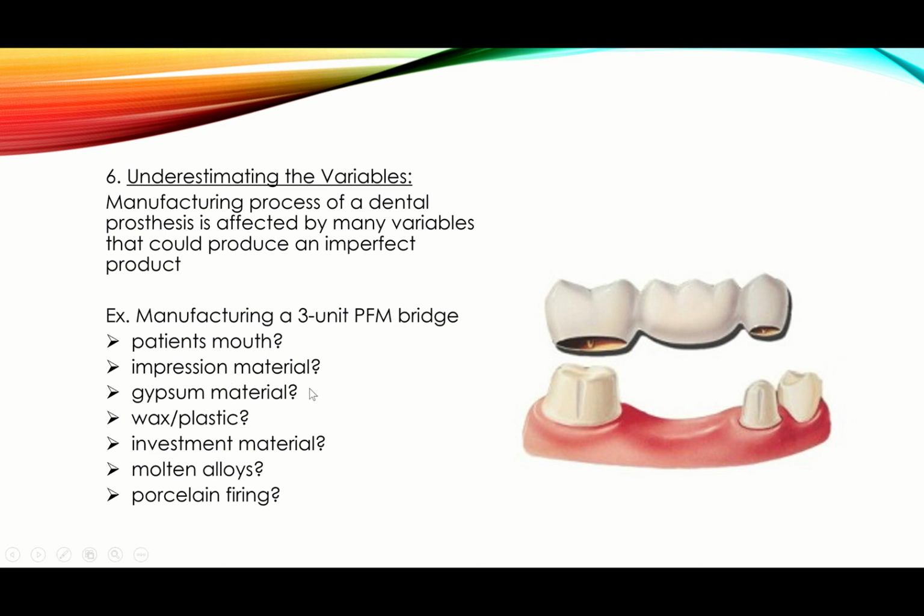How about gypsum materials? You poured your model. All gypsum materials expand as an end result. There's initial set and there is final set, and the expansion keeps going. There was a test run by Peter Beasy, if I'm not mistaken, about the final expansion. When does it stop? He invented his own gauge and measured that. They say final set is after 45 minutes or 1 hour, but he kept measuring and stopped the experiment at 24 hours, and there was expansion still.